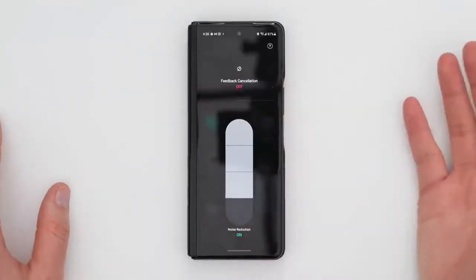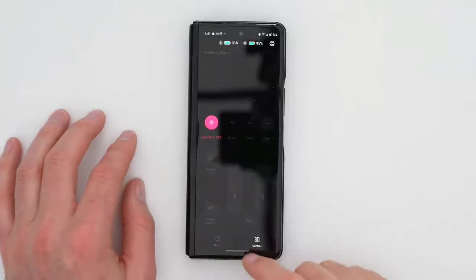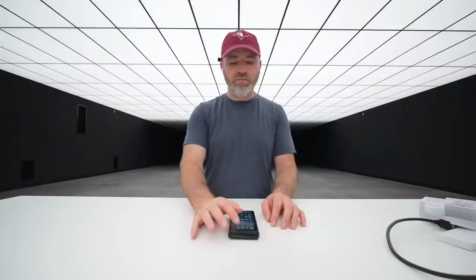This is the opposite effect. And this now is kind of like a noise cancellation, at least that's the way it sounds to me. There's just a general awareness. And then up here, that's gone. Hear through turned off, and I'll just go over and play some music here.